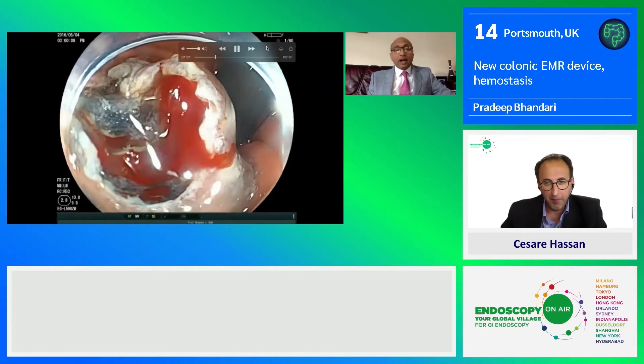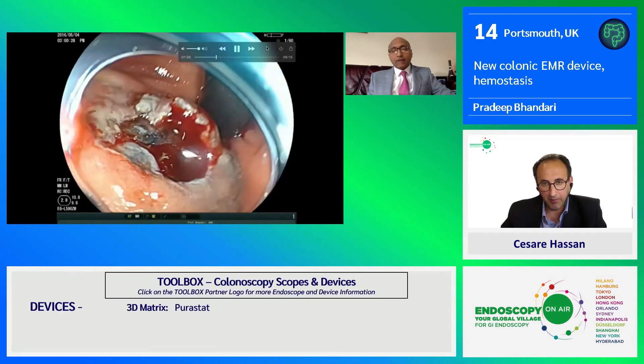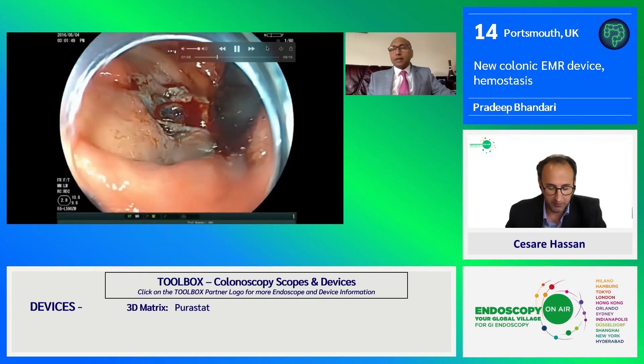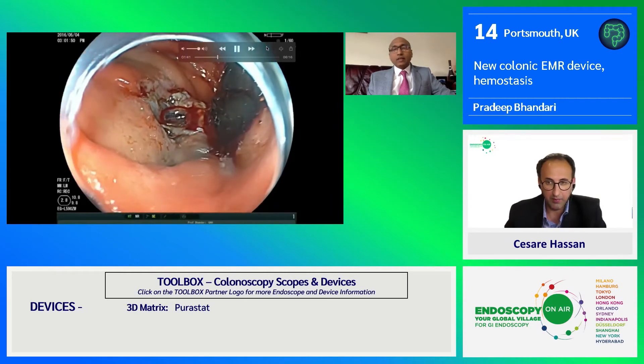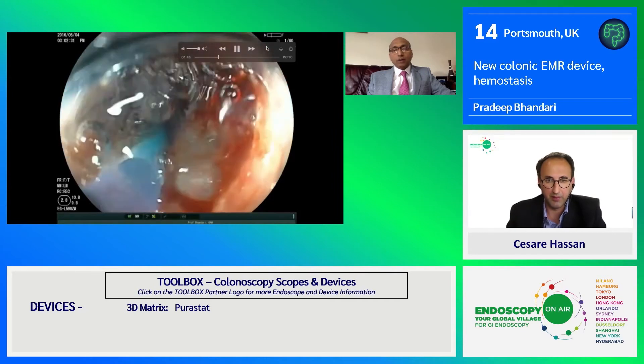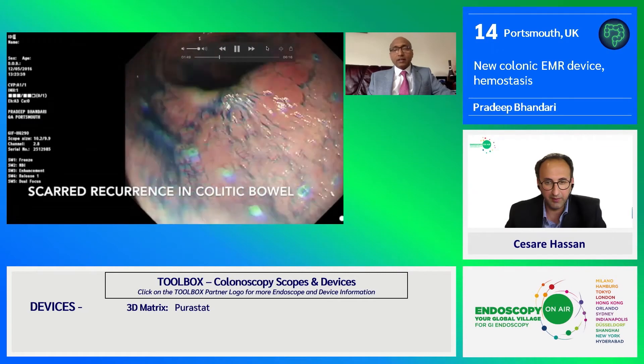This is a very high cardiac tumor. We can see this is a very vascular area. We see a lot of bleeding in this area, and you can see that after applying PuraStat, the bleeding stops and ESD continues. Because it's transparent, it doesn't interfere.